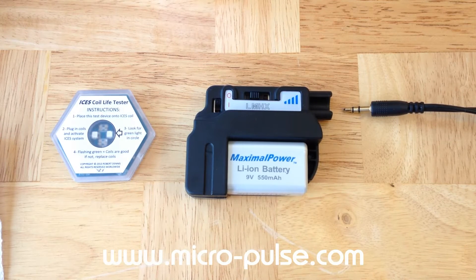This is MicroPulse video tutorial number 4: basic care and maintenance of your ICES PEMF system.